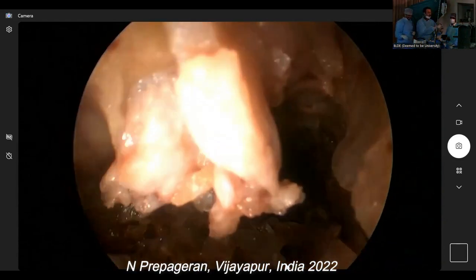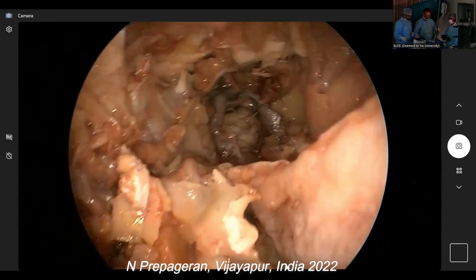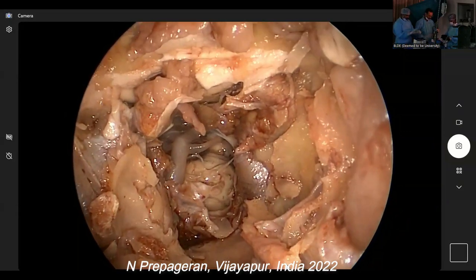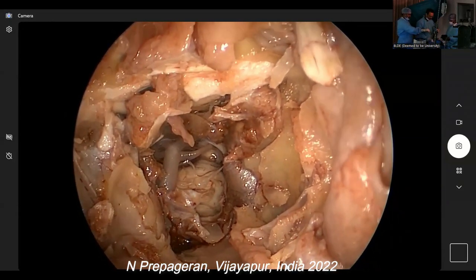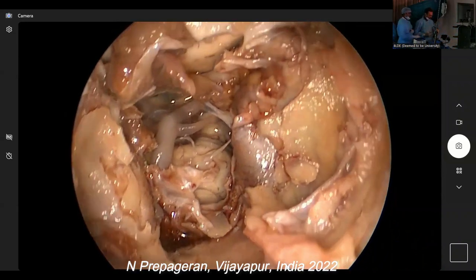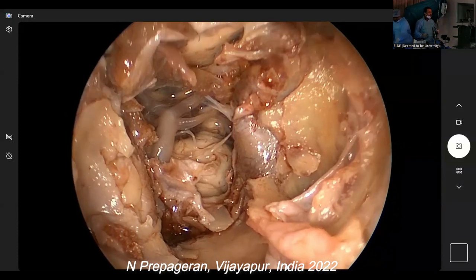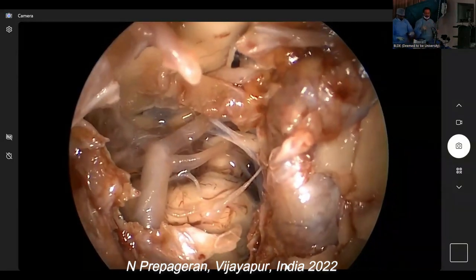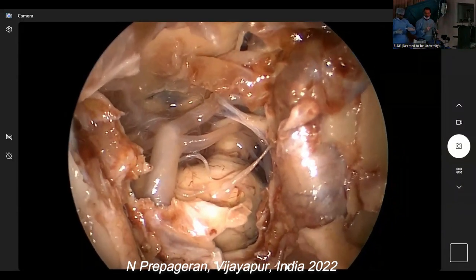Okay. So now, surgery done. Let's reconstruct. A big piece. Surgery done. You need to reconstruct. I think you need a bigger one, right? Just open the bigger one. Always practice to reconstruct, okay? So, I think it'll be nice for you guys, if you're free, to come and see the anatomy yourself, okay?